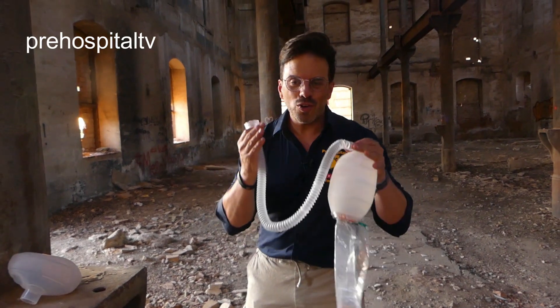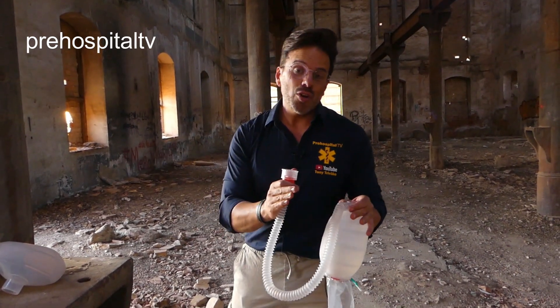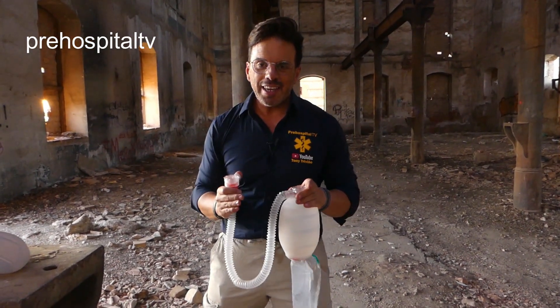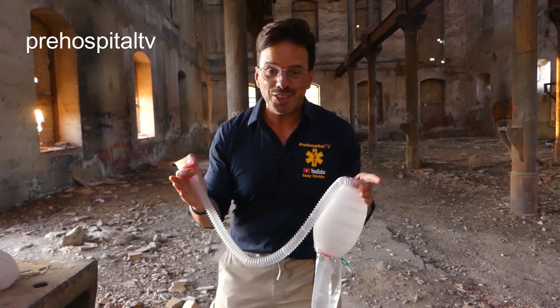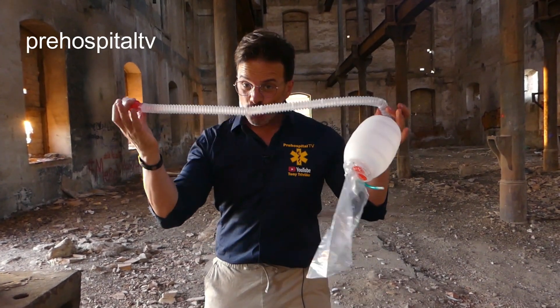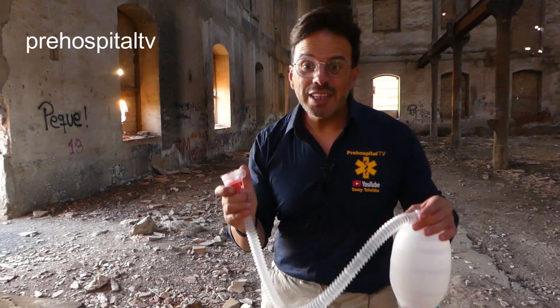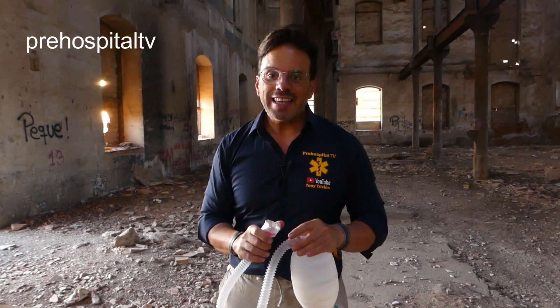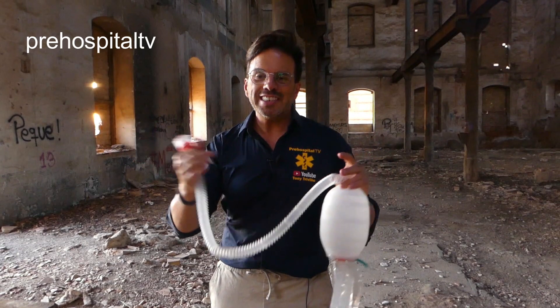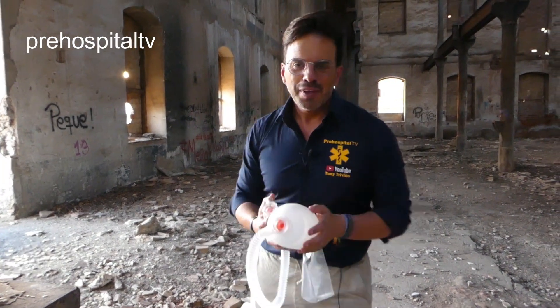The first advantage is that we gain space and comfort. If we have an intubated patient who needs to be ventilated and we have to evacuate through a narrow stairway, corridor, or tight space, a colleague at the head and another at the feet, there won't be room to ventilate without obstructing the others. The extender allows us to ventilate from behind or even from in front of the stretcher without getting in the way. In terms of safety, the extension tube reduces direct pressure, manipulation, and movement on the endotracheal tube, avoiding accidental extubation.